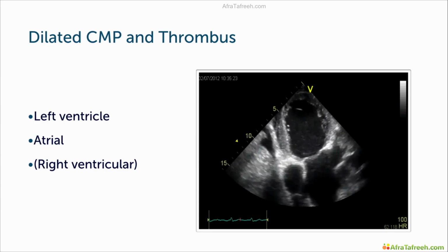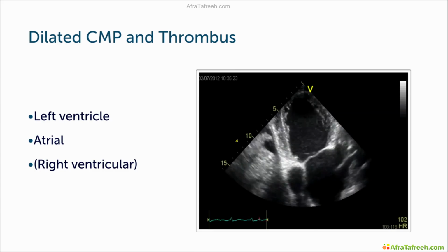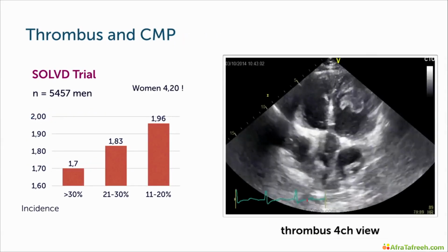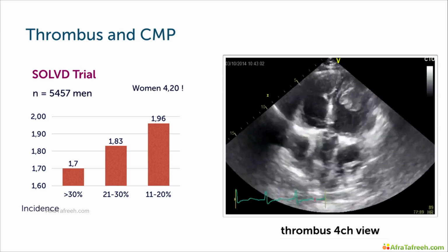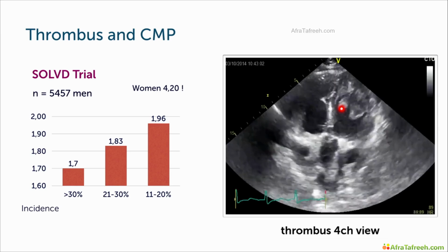If you look closely, you will see that this is the left atrial appendage here, that there's a thrombus in the left atrial appendage. Now, of course, normally you would use a transesophageal study to visualize the left atrial appendage, but in this case it was visible as well with transthoracic echo. This is the finding you'll find more frequently, namely a thrombus, in this case a relatively fresh thrombus, which is highly mobile in the left ventricle in a patient who has very poor left ventricular function.